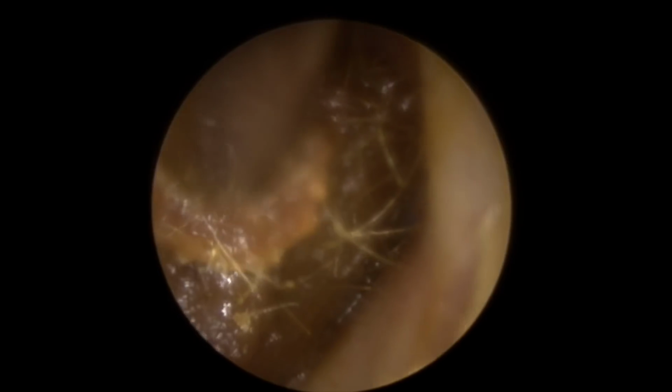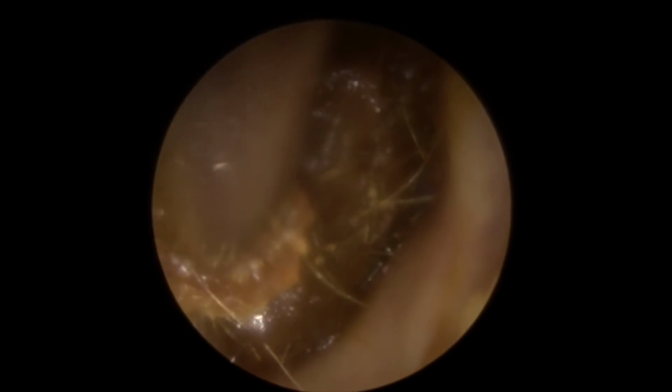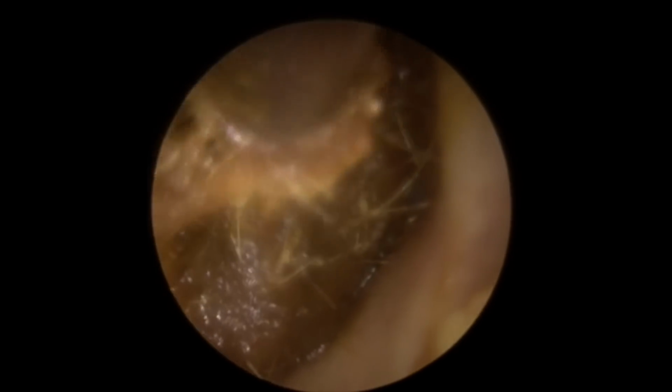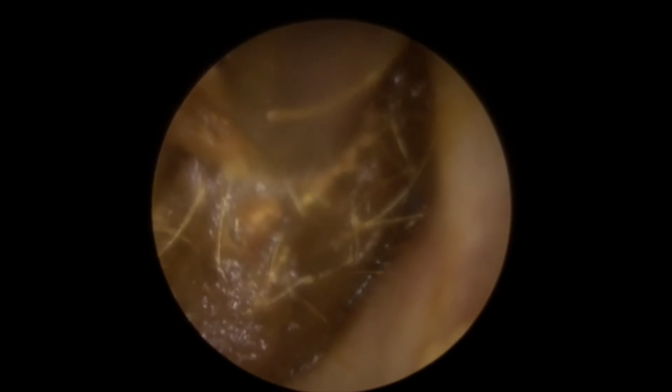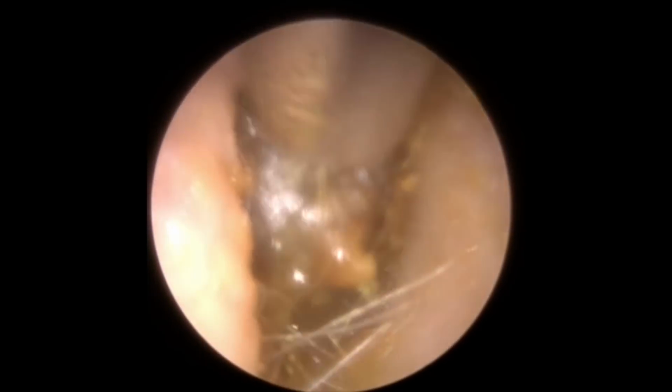So we just need to try and find a nice soft portion of this wax so we can get a good hold of it with the suction. Just struggling to find somewhere to grab. And now we start, there you go. There's a good grip. So we've managed to get hold of that now. Bring it to the outer part of the ear canal. We're going to have to wrestle this out a little bit. Lots of wiggling going on here to get this out of this canal.